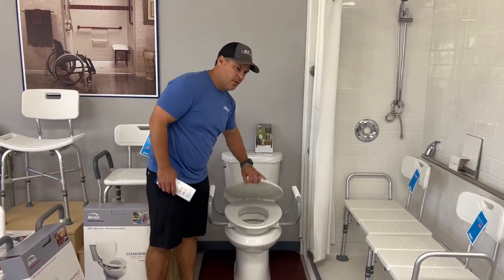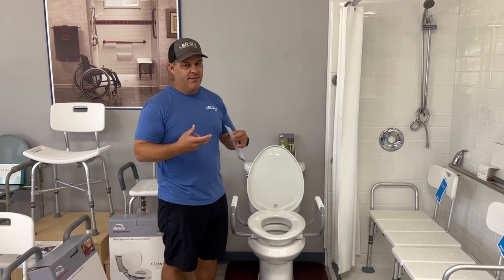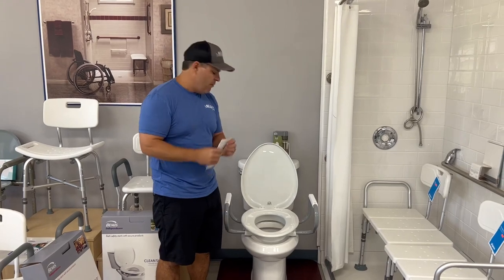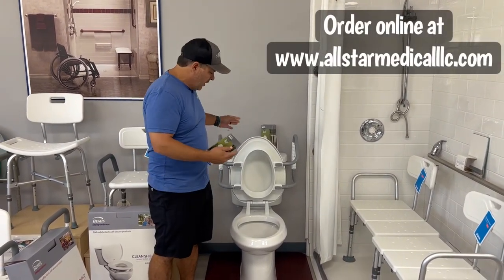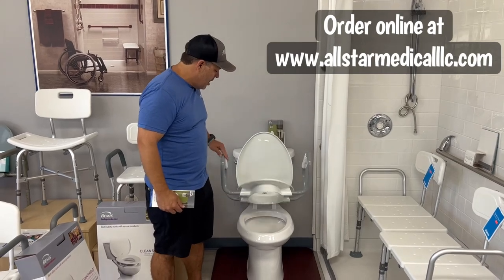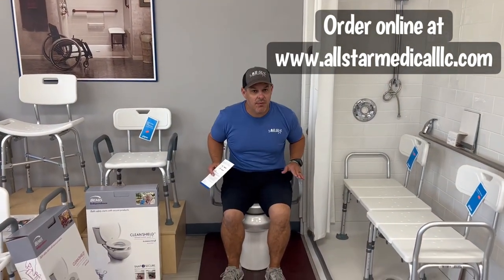If anybody's ever had to deal with a raised toilet seat before, you'll know that cleanliness is not the easiest thing. With the ones that actually mount to the commode, you have to disassemble and take them all apart. This one could literally be cleaned like your regular toilet. It has a thousand pound capacity on the actual seat itself.